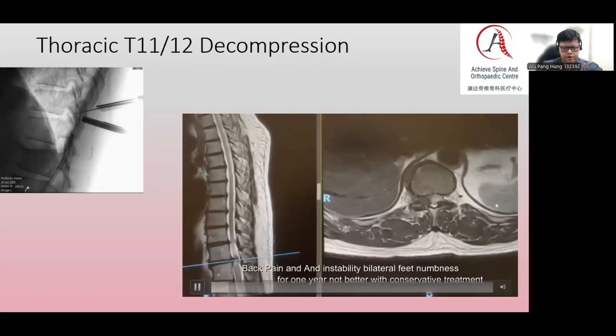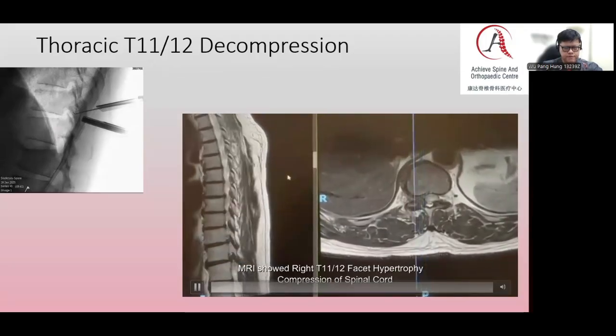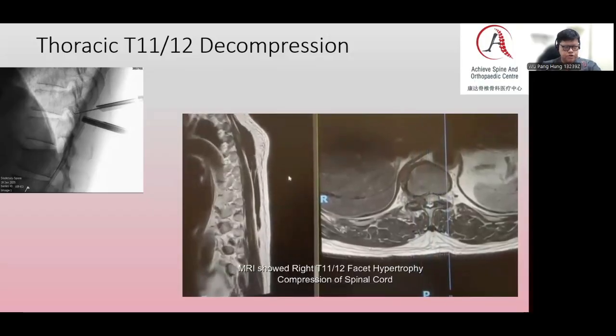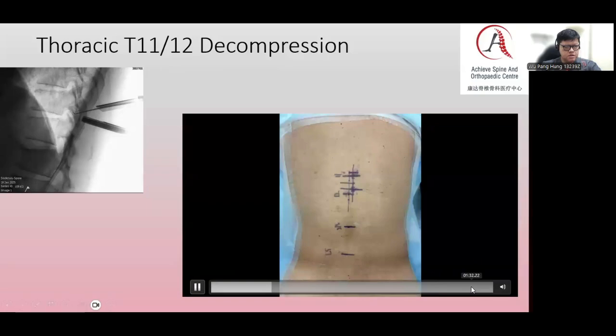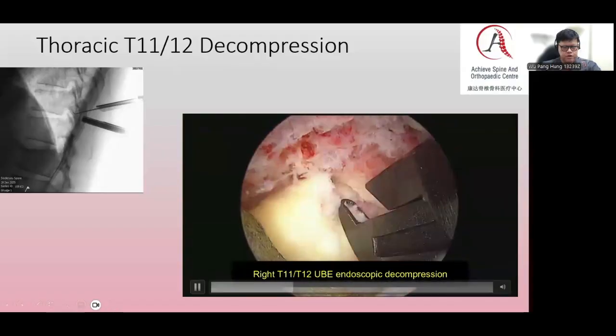You can see the MRI shows a significant compression of the nerve and spinal cord rather in T11-12. So we did an endoscopic decompression in this case. These are the markings. We mark all the way from T11 to L5. And then we did the UBE decompression first, T11-12.